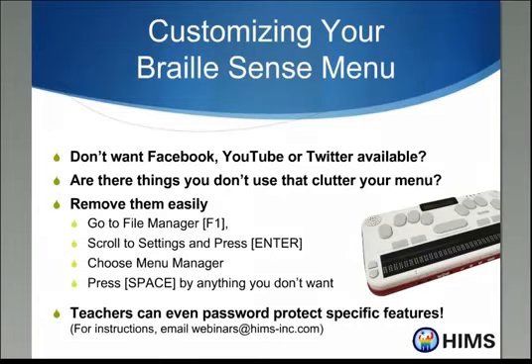recitation of all the really cool things that the BrailleSense can do, but they only give me a limited amount of time. I've already gone way over that amount of time, so I'm going to be quiet now and I will take questions. I'm going to just voice them out loud so that everyone can hear.